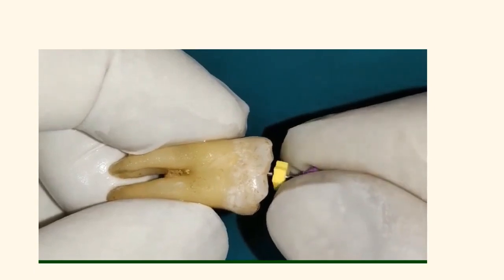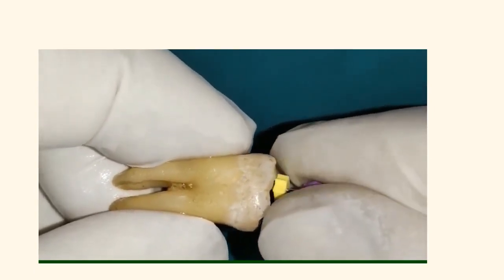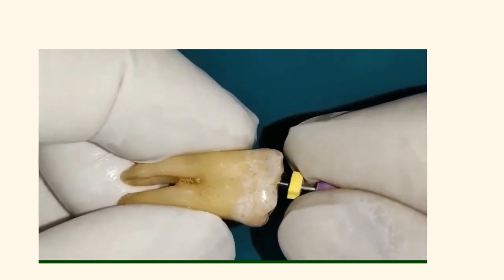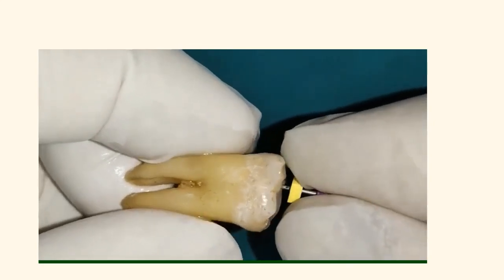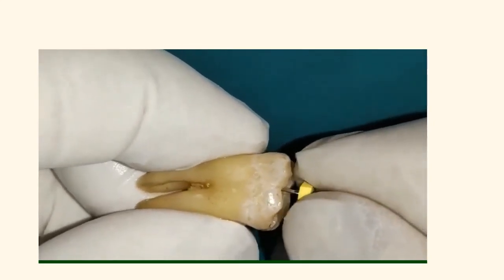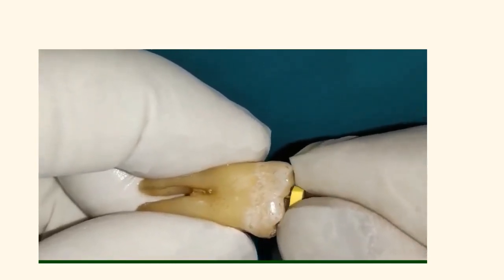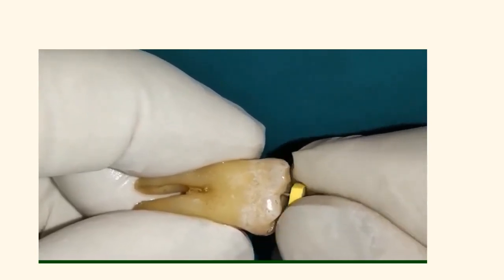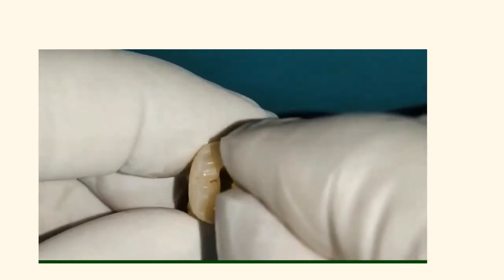This is a very gentle watch winding motion. You can see, don't force or push the file, otherwise you will definitely create a ledge or canal blockage. Once the file reaches the estimated working length and is a little loose, don't remove it. Now the instrument is made to work within the canal using a small up and down motion, not exceeding 2 mm, but always in the presence of sodium hypochlorite.